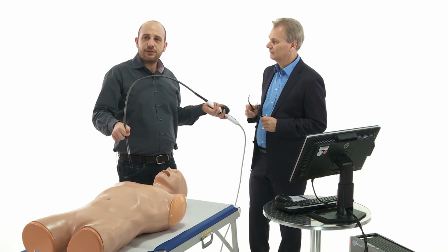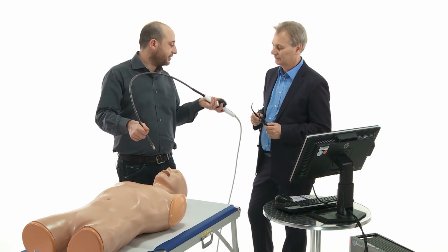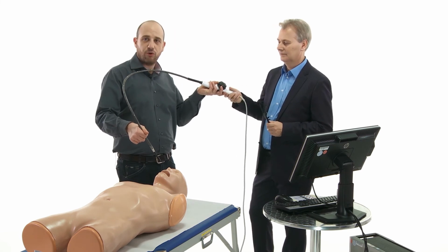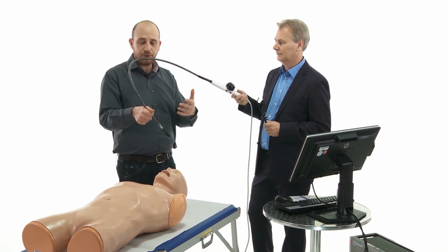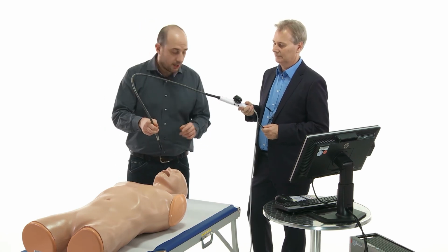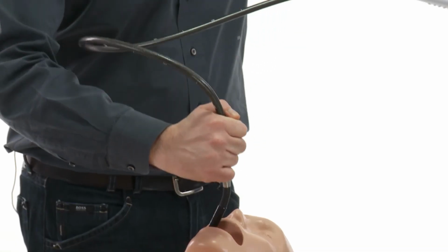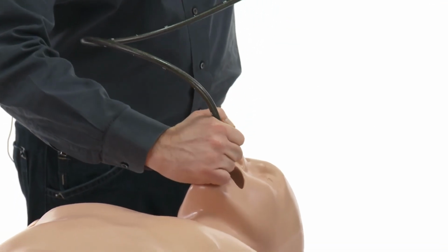Okay, what do we do? It's very helpful during the introduction of the probe that somebody holds the probe, because I can use both my hands with the mouth of the patient. So we perform a little bit of anteflexion, good, and we go inside.